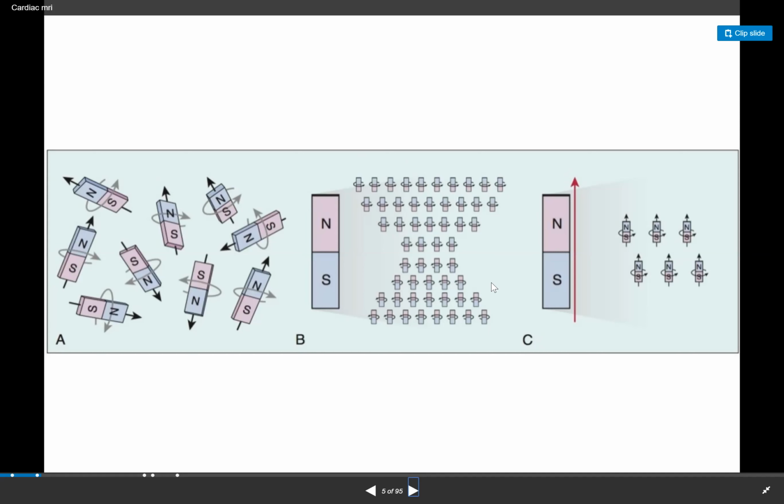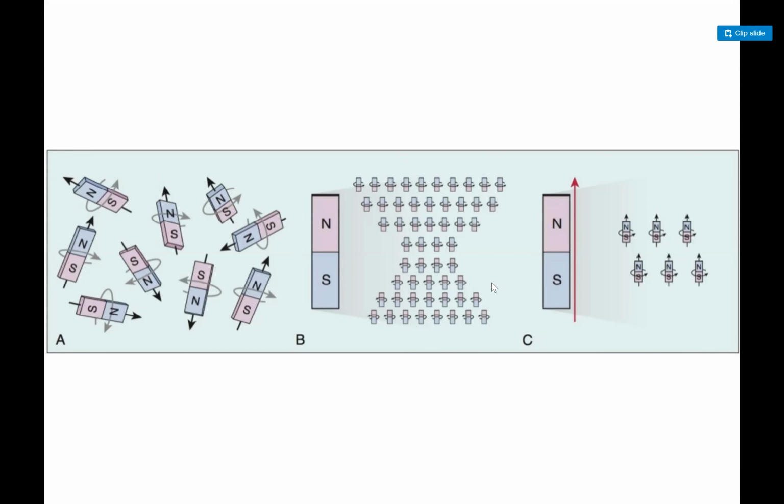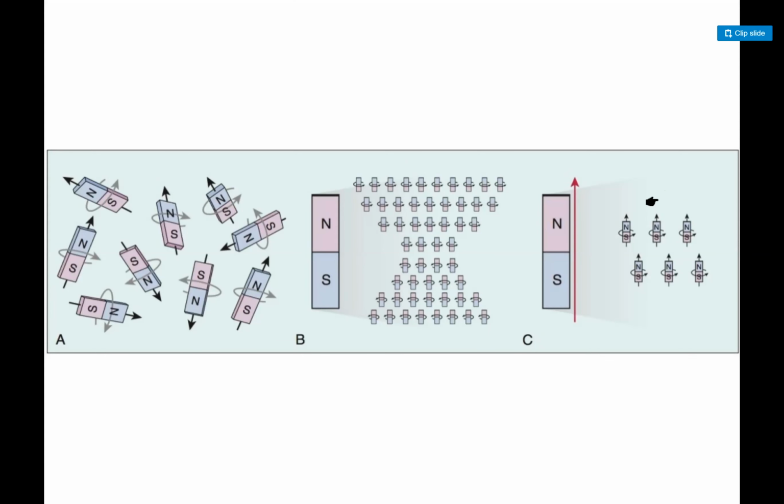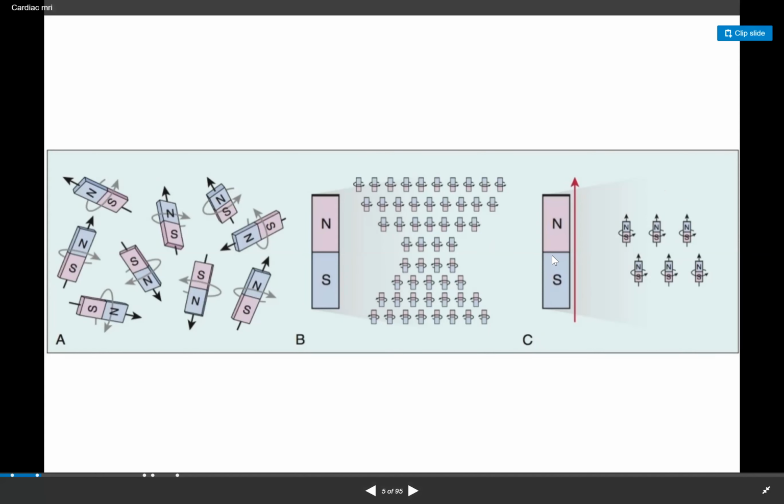With every million protons, there might be 6 or 7 protons directed more towards the north because of the magnetic field. So this is the extra magnetization. What does magnetization mean? That the body changes into a north and south pole, just like a magnet. And when it's directed in the upward direction, more of them are in the north direction.